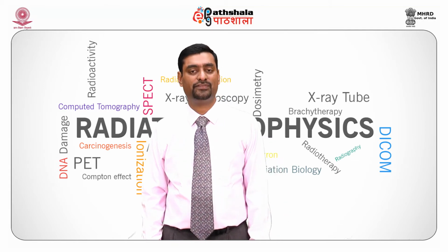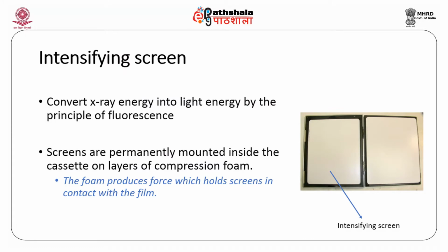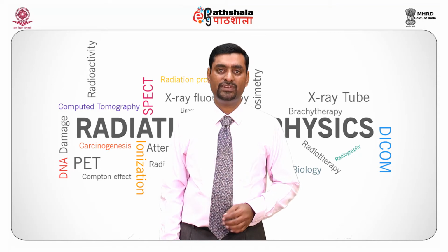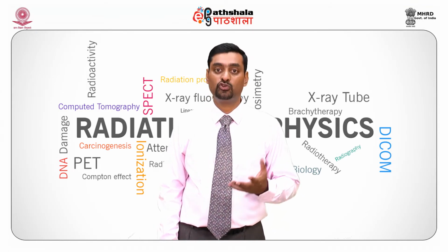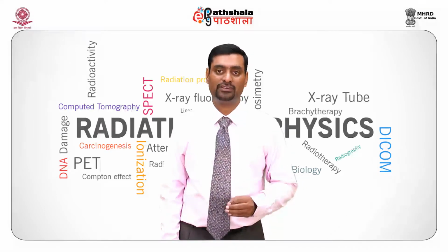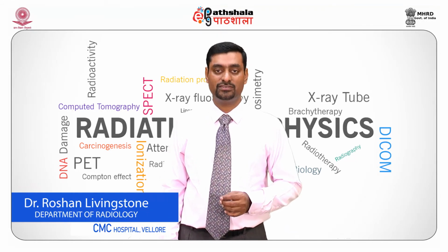Now moving on to the intensifying screen. What is an intensifying screen? As you see in the image, the function of the intensifying screen is to convert X-ray energy into light energy by the principle of fluorescence. What is fluorescence? When certain materials are hit by X-rays or electromagnetic rays, they produce light. This light stops emitting soon after the stimulus, which is X-rays, is also stopped. This principle is called fluorescence.